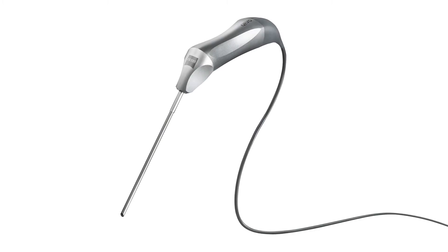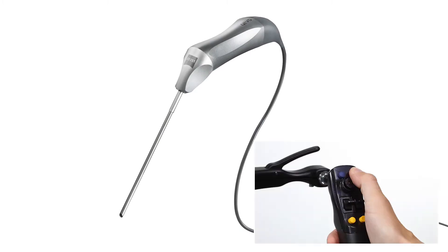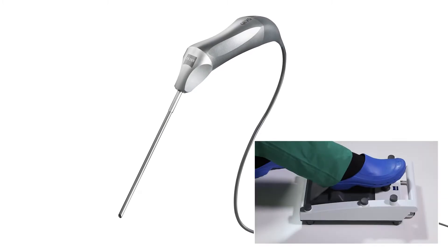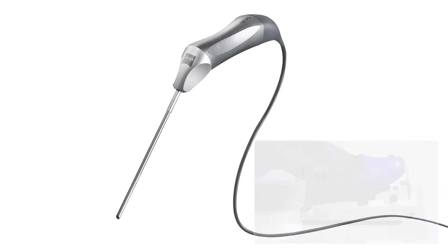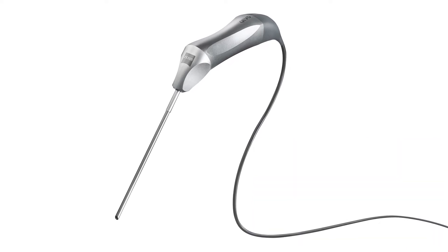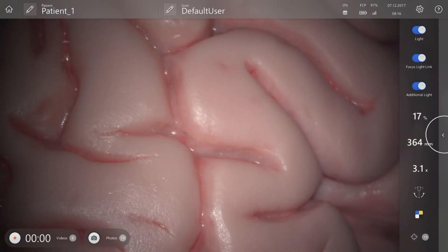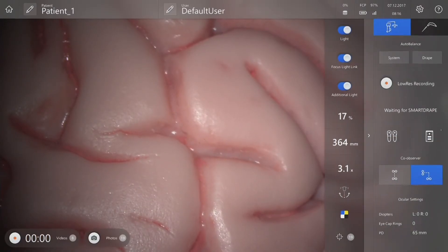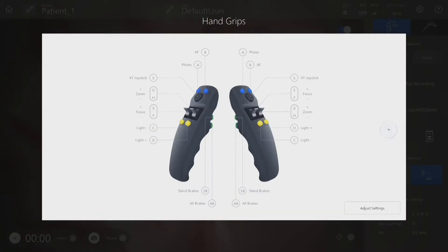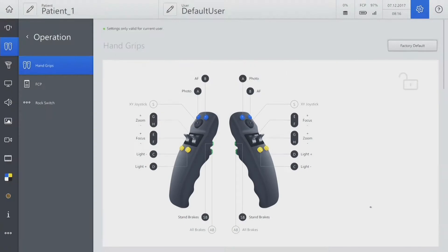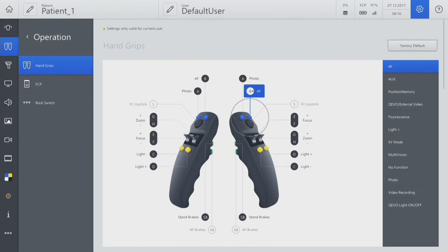Zeiss Kivo can be configured on one of the buttons on the handgrip or foot control panel. To configure the handgrip, go to the icon on the main screen and go to Adjust settings. Configure the top blue button on the right handgrip for Zeiss Kivo.